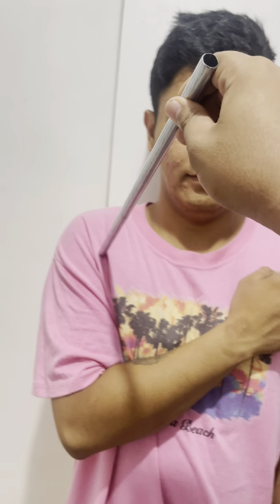Next projection is glenoid cavity AP axial oblique projection, Garth method. Angled 45 degrees caudad through the scapulohumeral joint. Yan po, parang nagpapanatang makabayan po tayo. And then 45 degrees caudad.